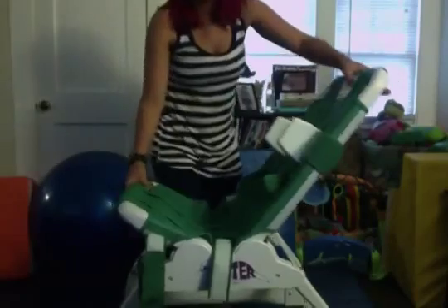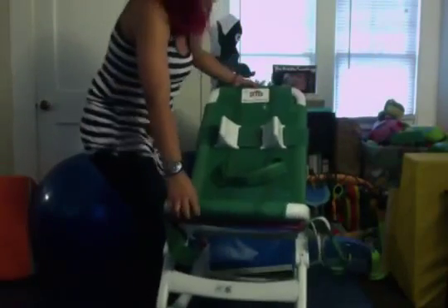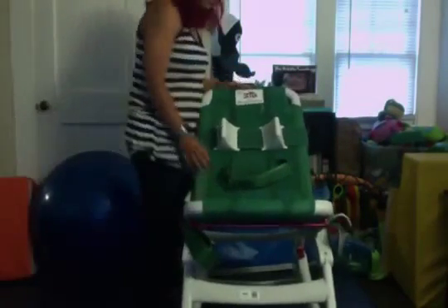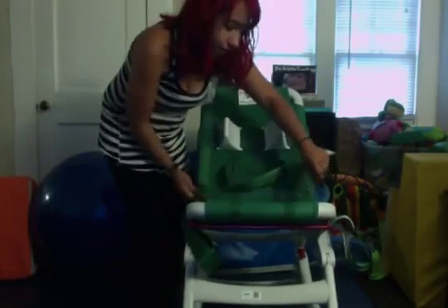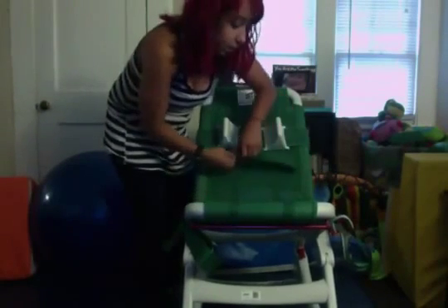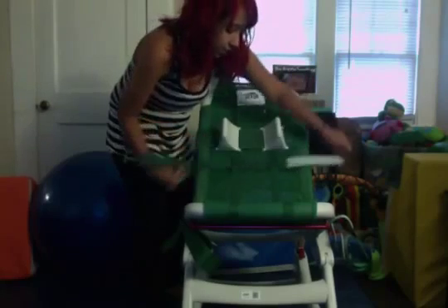Now you've got it all put together — your headrest, your body straps, your leg straps and all that. I'm going to show you what Parker looks like in it.